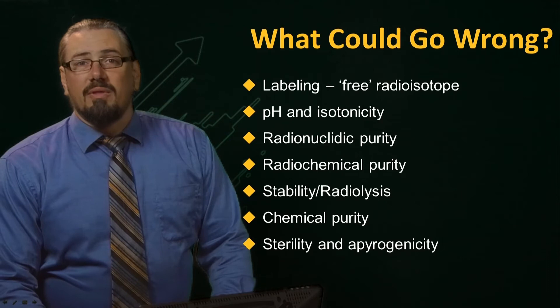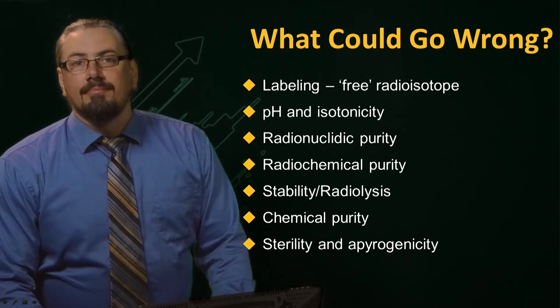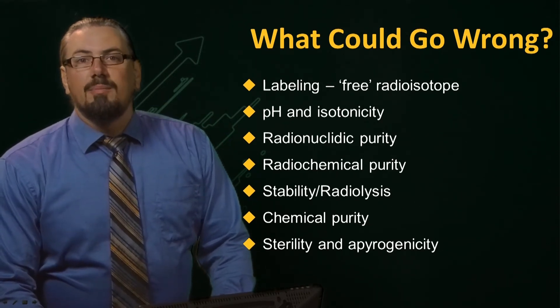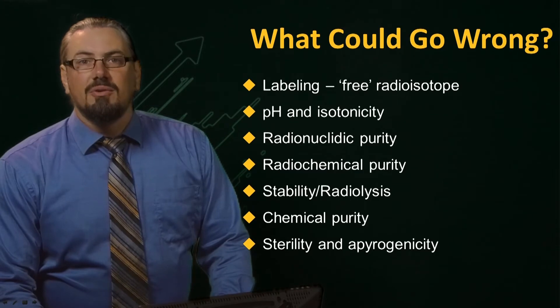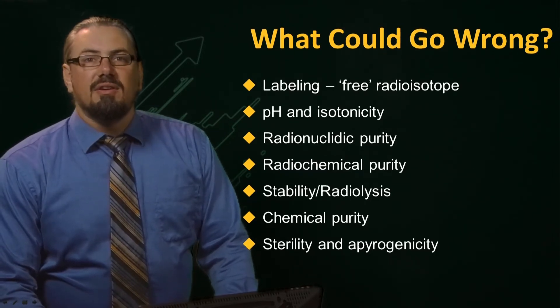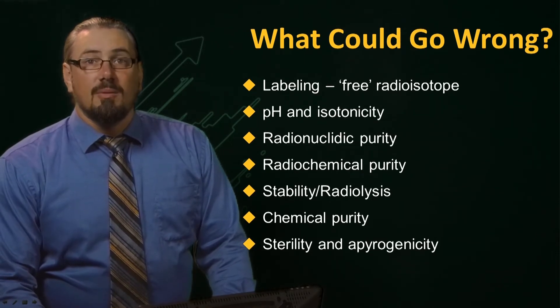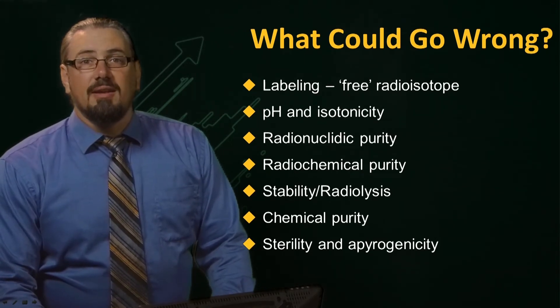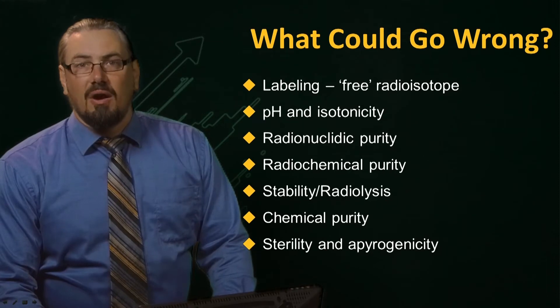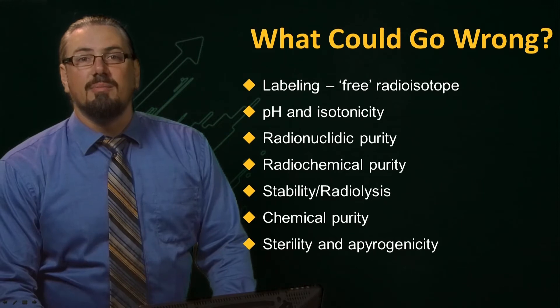So what could go wrong in the manufacture of radiopharmaceuticals? There could be poor radiolabelling of the particular pharmaceutical component resulting in free radioisotope, which can adversely affect the usefulness of the preparation. The pH or acidity, along with the isotonicity or ionic strength of the radiopharmaceutical, may be incorrect, causing problems to the patient during administration.